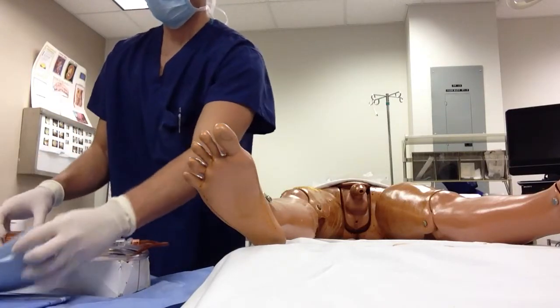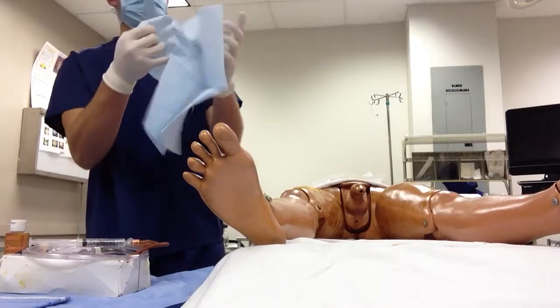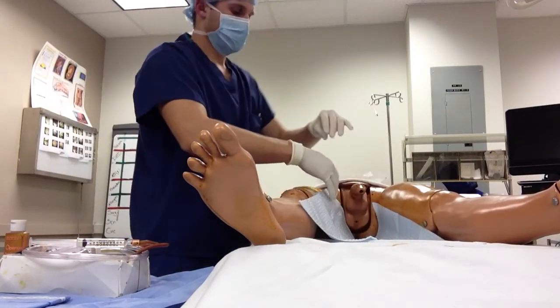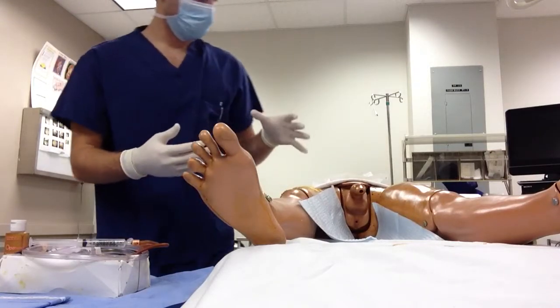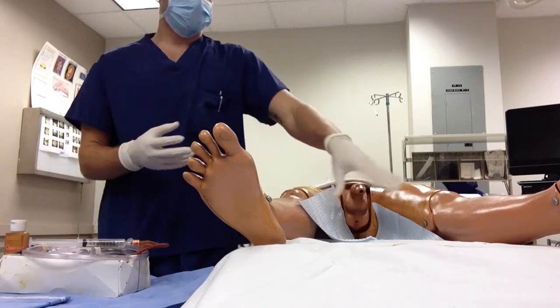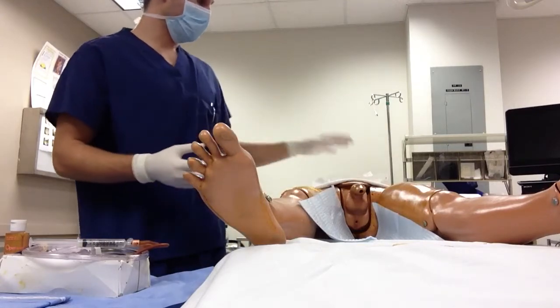First, lay your sterile towel down in between the patient's legs. This catches any drippage off of the penis, and you can also place your trash nearby for easy disposal during the procedure.